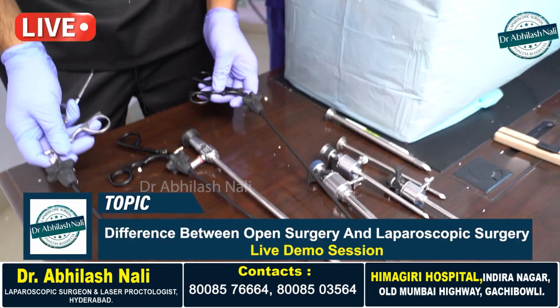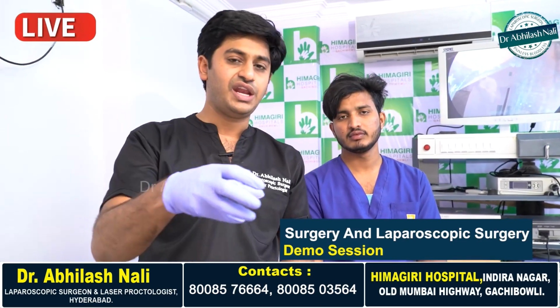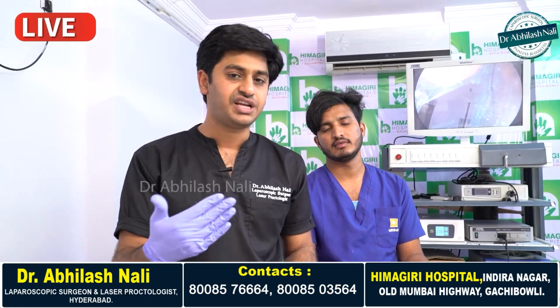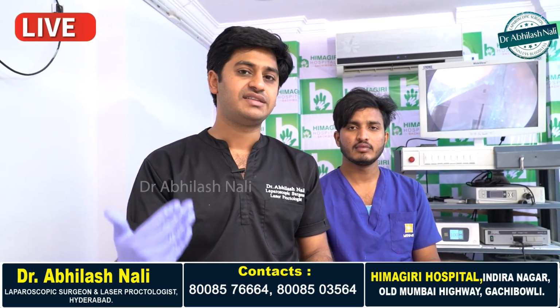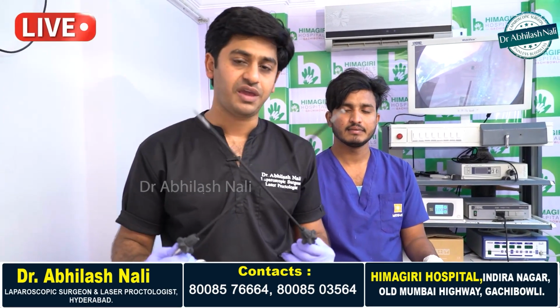How these actually help is, generally in conventional open surgeries, we need to grasp or do the surgery with a surgeon's hand. Whereas in laparoscopic surgery, there won't be any contact of the surgeon's hands with the abdominal organs. But how exactly are we able to do the surgery? Because of the help of these laparoscopic instruments.